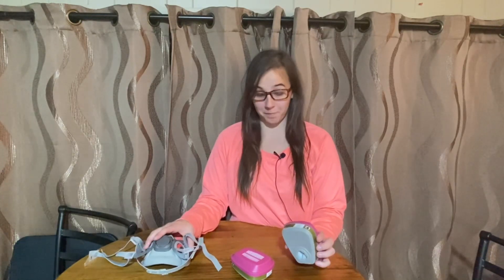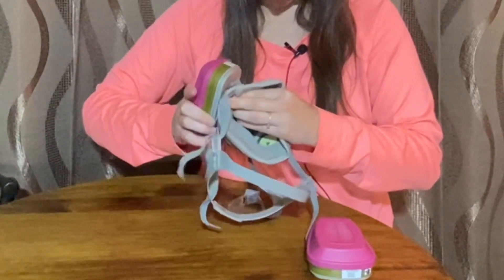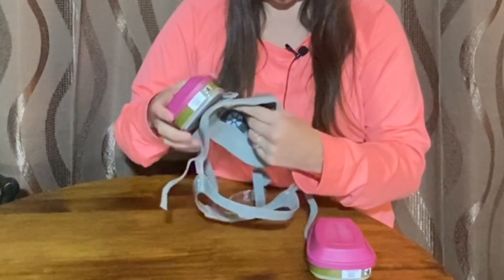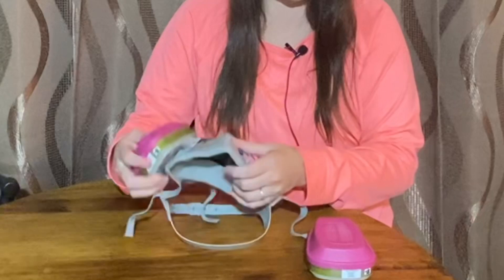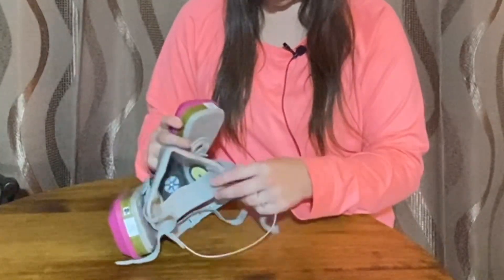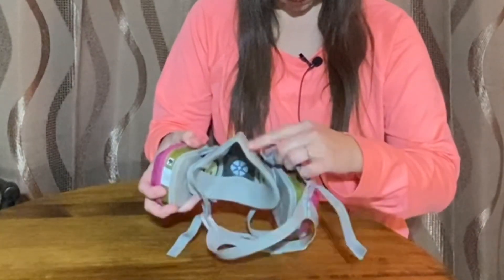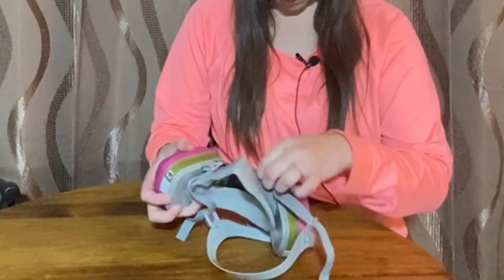I'm going to be installing these filters on our mask. You're going to want to make sure the larger part is on the top and the smaller part is facing towards the bottom. Then they just go on like that.